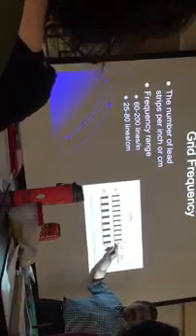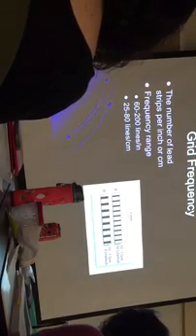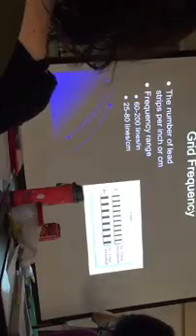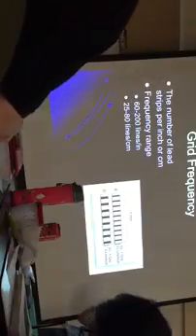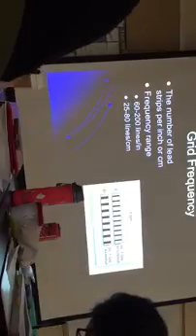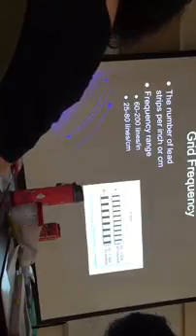The advantage of this grid is that you will see fewer grid lines. That's the whole thing. So that's what grid frequency is telling you: how many lines you have squeezed within a space, whether an inch or a centimeter. Grid ratio is telling you how much scatter radiation you can absorb. Two different concepts. Let me repeat it. Grid ratio tells you how much scatter radiation you can absorb. Grid frequency tells you that you're going to see fewer grid lines.